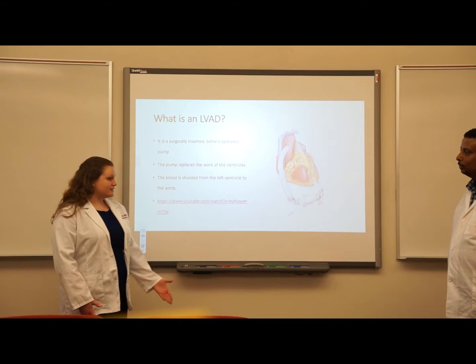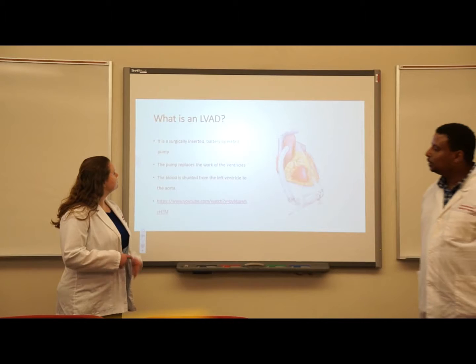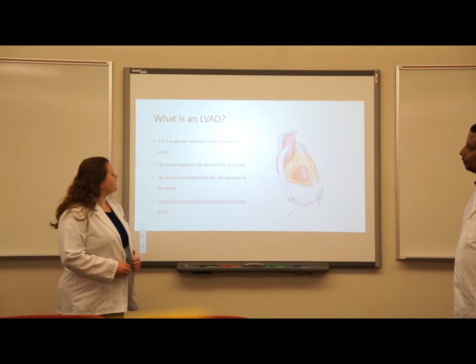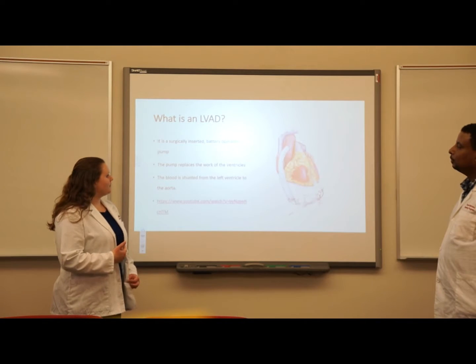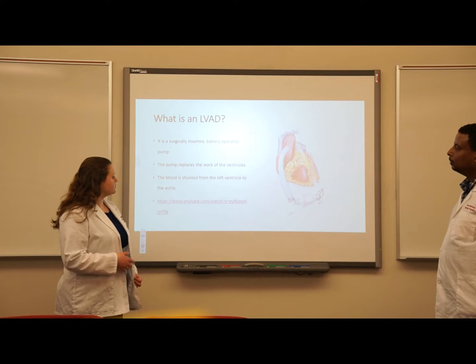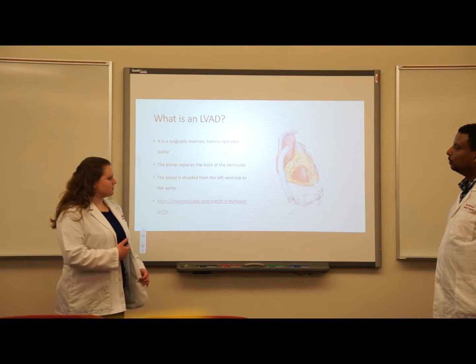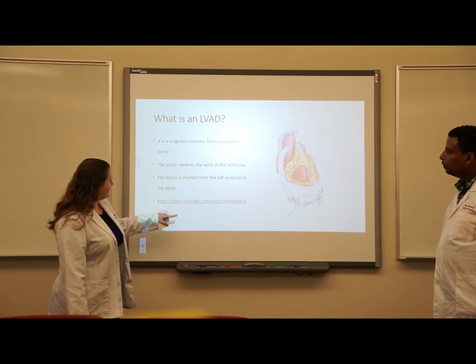Do you know what an LVAD is? No, I don't know. I have heard about it, but I don't know what it is and what it does. Okay. So an LVAD is a surgically inserted battery-operated pump, and it replaces the work of the ventricles, and in this case we're talking about the left ventricle. The blood is shunted from the left ventricle into the aorta, and I have a video here that shows you how the pump operates.